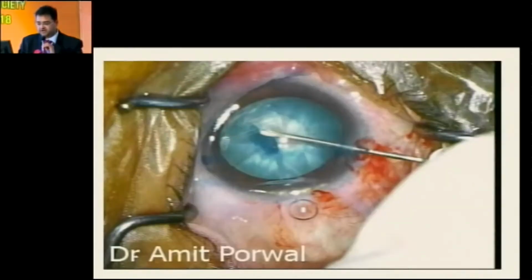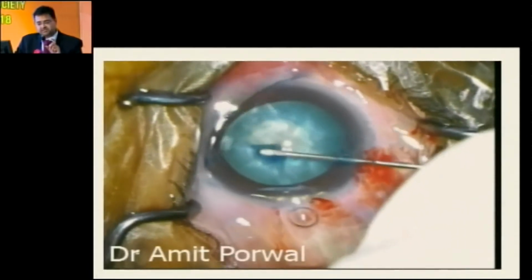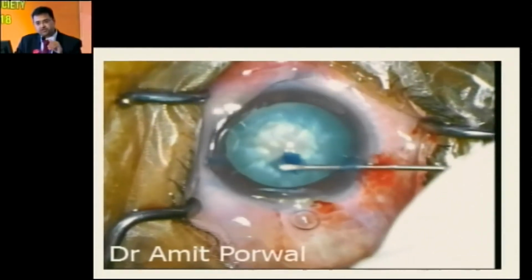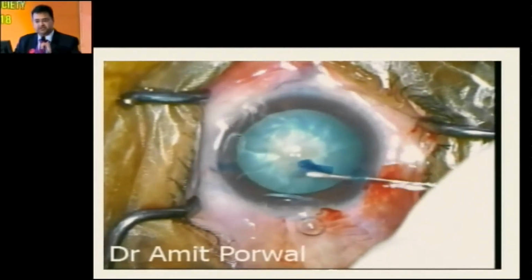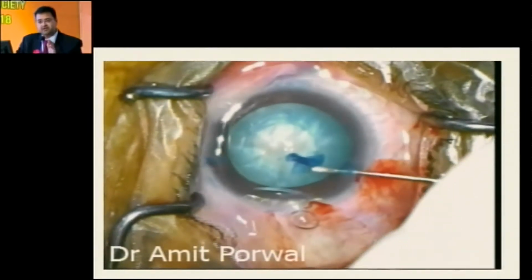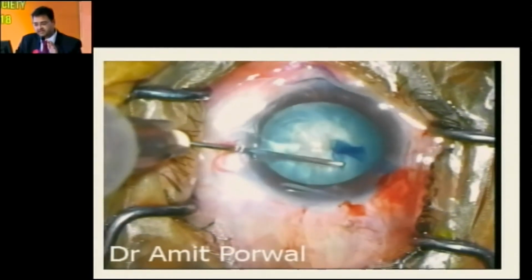Another option you have is the onion pattern rhexis, also called a snail pattern rhexis. In this, once you have started the rhexis, do a small rhexis, and once you are reaching the beginning point, you go beyond it and then again peel it off as if you are peeling off the skin of an onion, or it's the snail pattern rhexis. By doing this, you have more control over your rhexis. This is another option available, but I would prefer to do a 2-stage rhexis at any given time, because the smaller the rhexis, the chances of giving way are very less, and you can play with it.